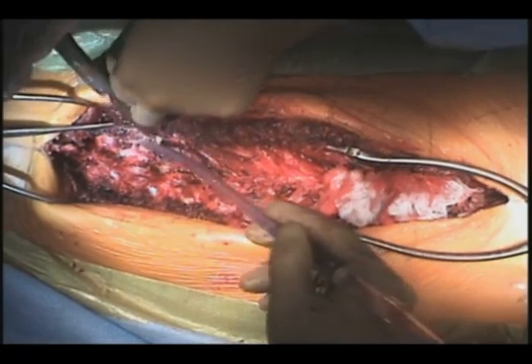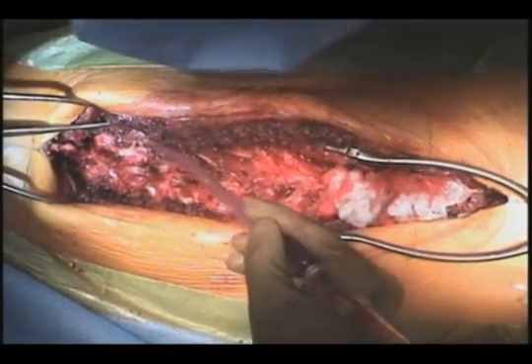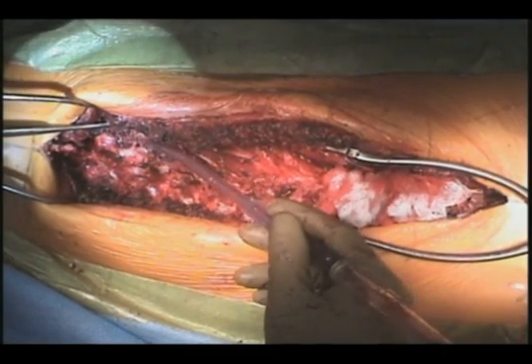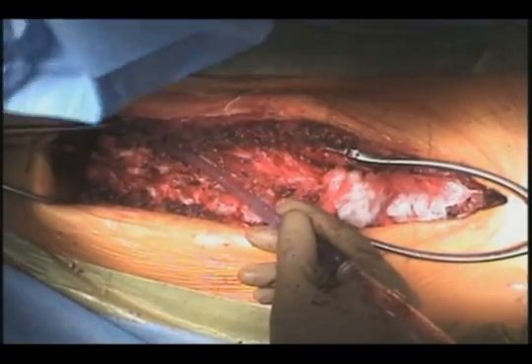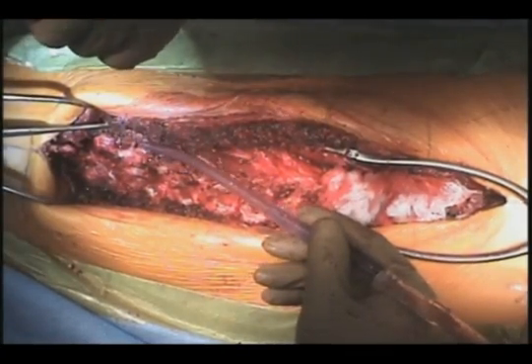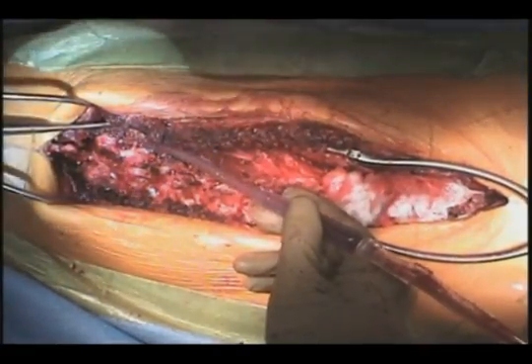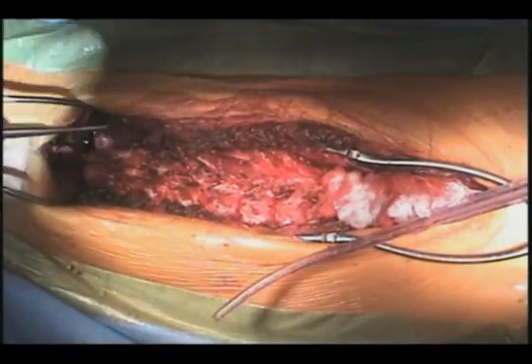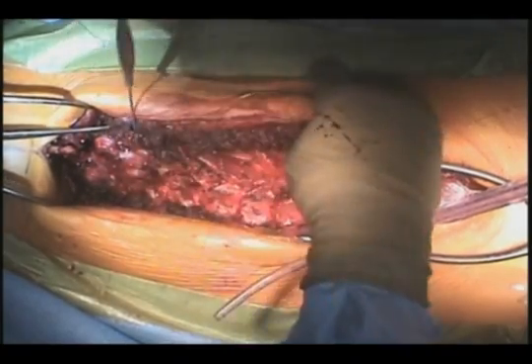I'm now placing pedicle screws, starting in the lumbar spine on the concave side. I use a high-speed burr to enter the introitus of the pedicle, and then I take a 2mm drill bit, which I have marked and calibrated for the length that I need. This is a fine technique that allows me to enter the pedicle continuously feeling the tip of the drill. I find this to be the safest approach rather than using a pedicle probe, although I do use the probe in certain circumstances, typically at the upper end of the construct.